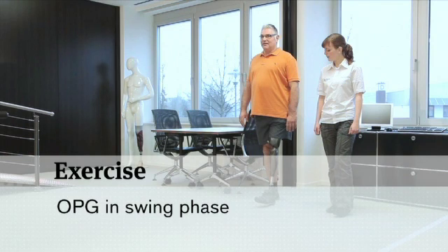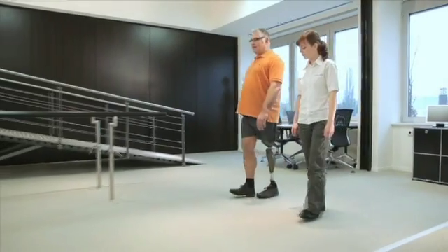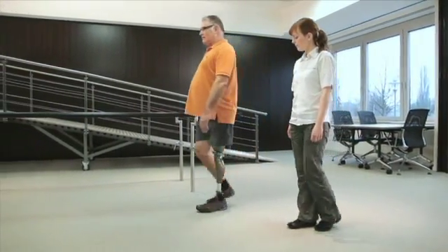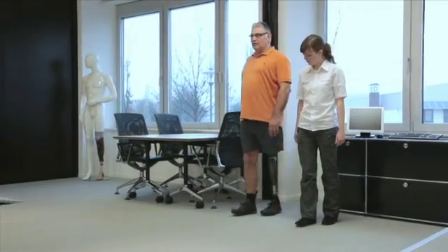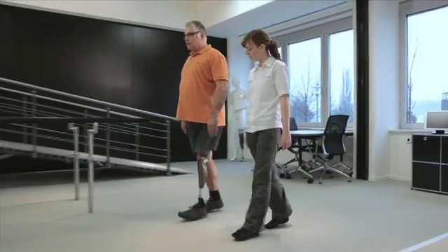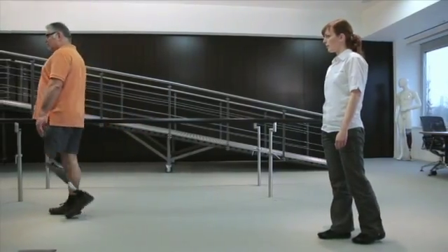Adaptive swing phase control. Adaptive swing phase control offers swing phase quality comparable to that of non-amputees. There are several training exercises to support the user. First, train the user to vary his step lengths. Have the user walk as slowly as possible. Then have him try this with various step lengths. Make sure the user loads the prosthesis properly while maintaining the appropriate step rhythm.